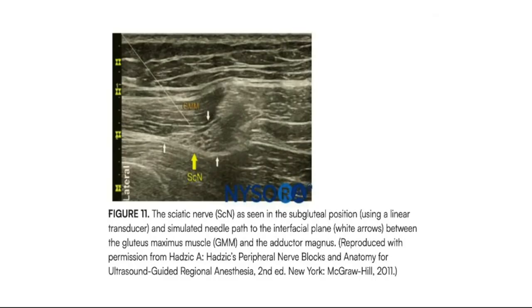The issue if you miss it is not just lack of efficacy, but also safety. If you do a popliteal nerve block, for most Malaysians, we do an injection from the lateral side, and therefore our needle is parallel to the ultrasound beam. So if you misidentify where the nerve is, there's a risk of impaling the common peroneal nerve.